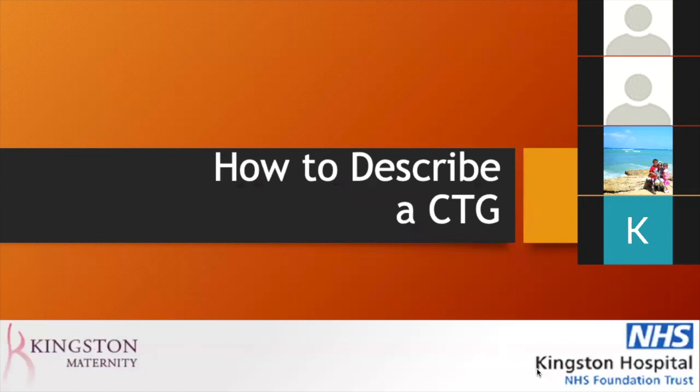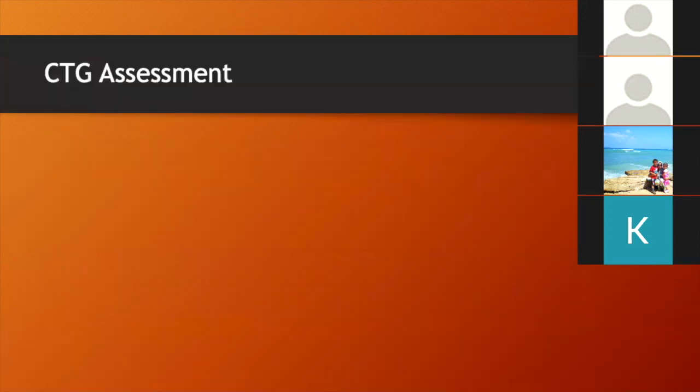So the next part of the presentation is going to be how to describe a CTG. As I said, this is just an example CTG. We're taking just the general gist. Most of the time, it's going to be somebody else presenting the CTG, not me. So you're not going to have me for an entire session. That's not usually helpful. I know that. I have 10 minutes to sum this up somehow.